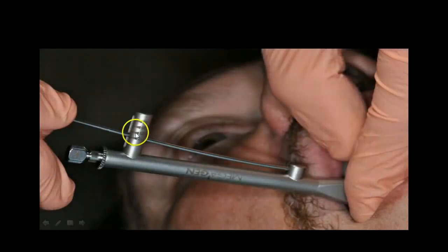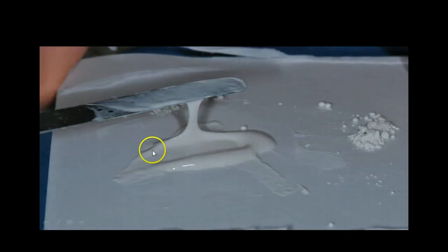And now we're going to torque this baby into place. With this implant, you're going to range anywhere from 25 to 35 Newton centimeters, because with the Anyridge system, there is really no set torque amount. 35 is plenty, 25 is plenty, again, because of the definitive nature of the 5-degree Morse taper. So a range from 25 to 35, depending upon the torque wrench that you may have. Different torque wrenches work very well with the MegaGen system.